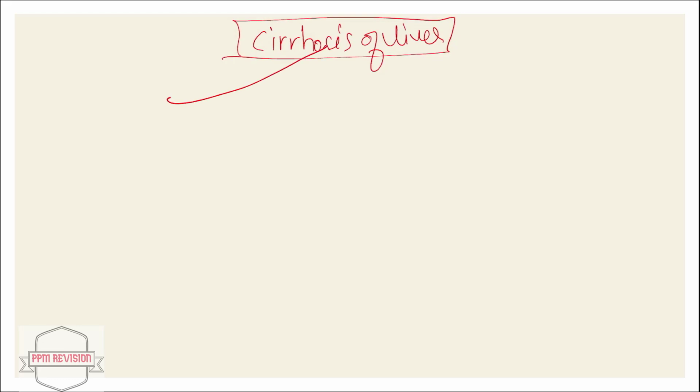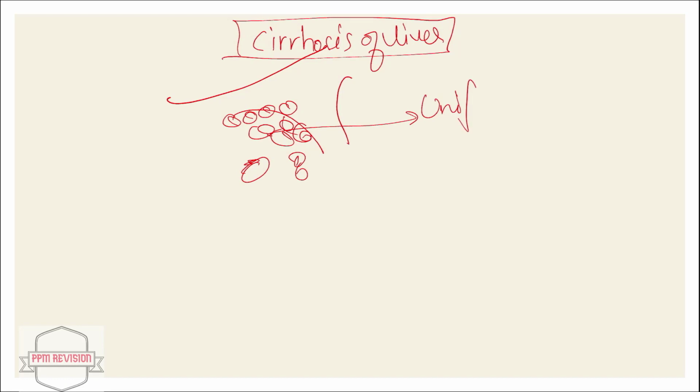So for cirrhosis of liver, mainly you can draw the uniform micronodules, right?